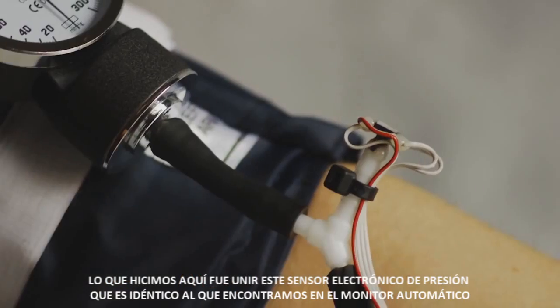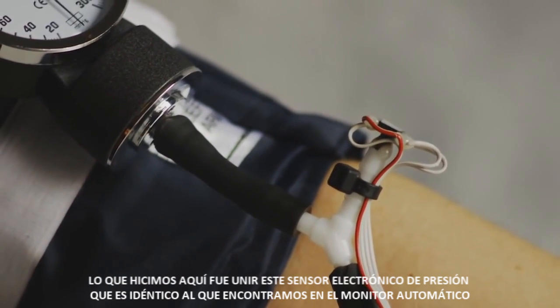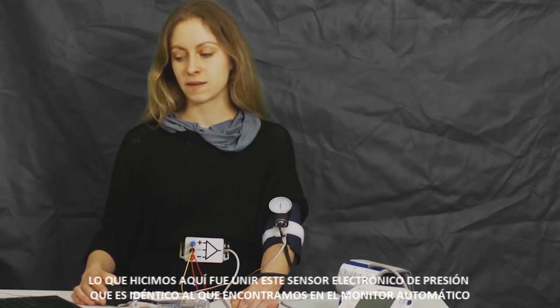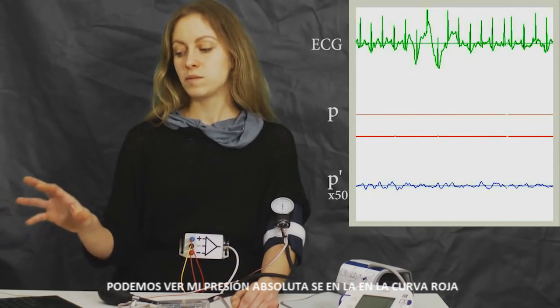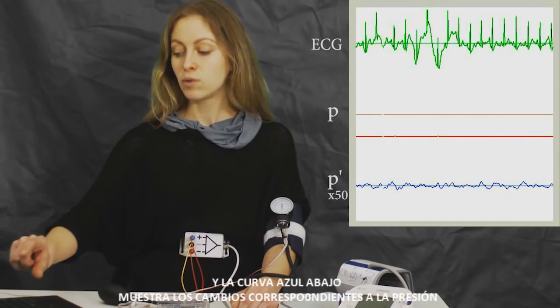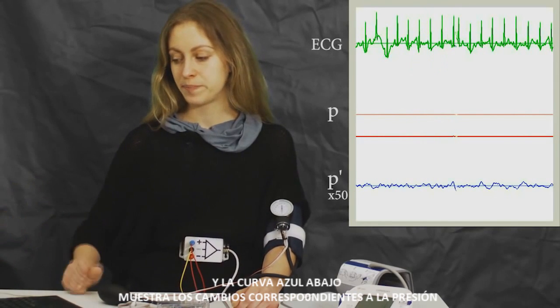But what we have done here is that we have attached this electronic pressure sensor that you can see here, which is identical to the one found in the automatic blood pressure meter. So now, if we look at the screen, we see that my absolute pressure is depicted in the middle trace, the red one, and the lower trace, the blue one, shows the corresponding changes to my pressure.